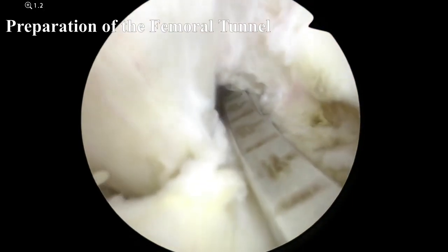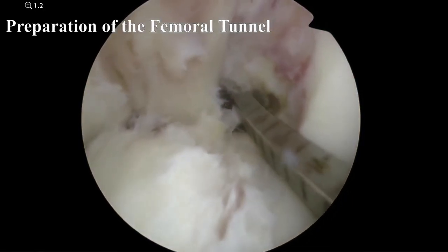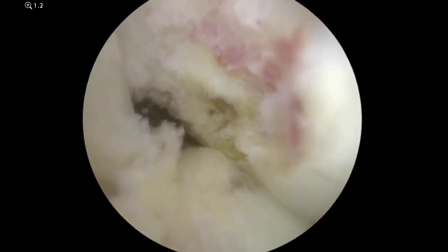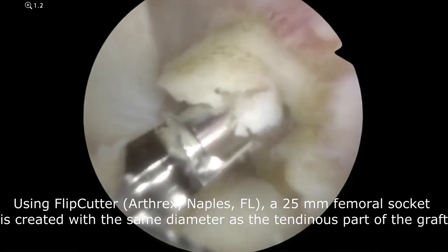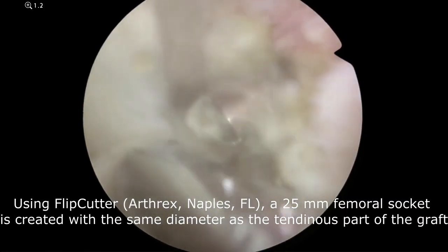The ACL femoral footprint is located and the remaining soft tissues are excised. By using a flip cutter, a 25 mm femoral socket is created with the same diameter as the tendinous part of the graft.